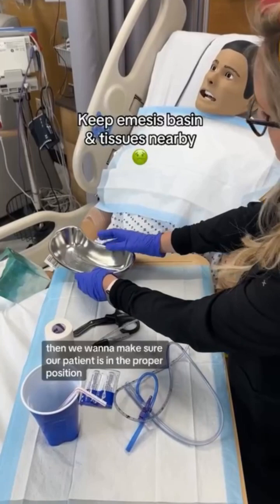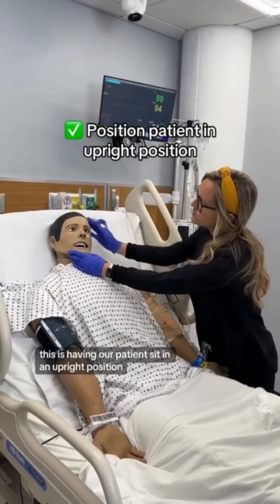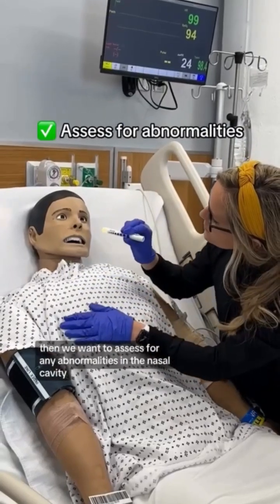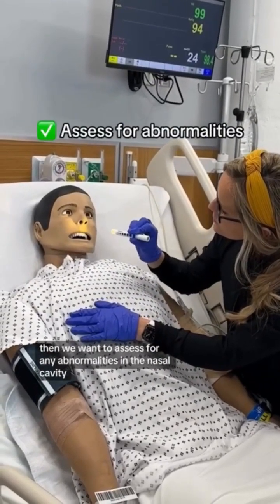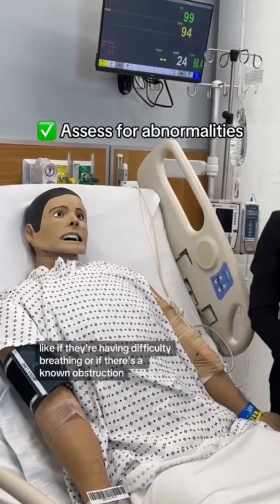Then we want to make sure our patient is in the proper position, having our patient sit in an upright position. Then we want to assess for any abnormalities in the nasal cavity, like if they're having difficulty breathing or if there's a known obstruction.